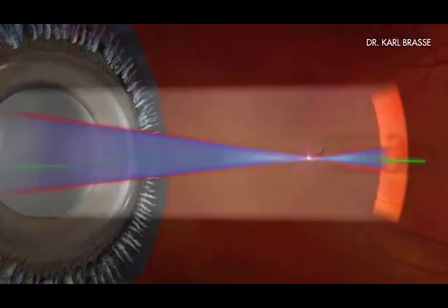In comparison to other ophthalmic YAG laser applications, YAG laser vitreolysis differs predominantly by its specific technical equipment requirements. In addition, treatment is more complex and time-consuming. It requires appropriate experience and knowledge of the surgeon. It should be carried out with utmost care and accuracy.